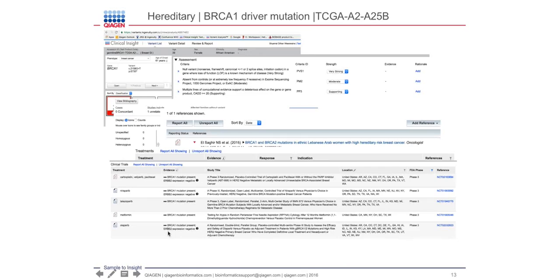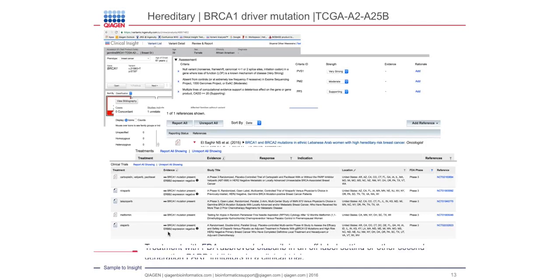So it's really a clinical trial that this patient could be enrolled in today. So this is a nice example of a clinical trial that could be added to the report as well if the clinical team decides that it's not appropriate to go in an off-label situation for this case. But you still have hope because there are clinical trials that are open. So in summary, you can see and access different FDA-approved information such as olaparib in an off-label setting for this particular case. But you can also look into a second-generation PARP inhibitor as a clinical trial, and I mentioned olaparib, but there are a few other clinical trials in this particular case.